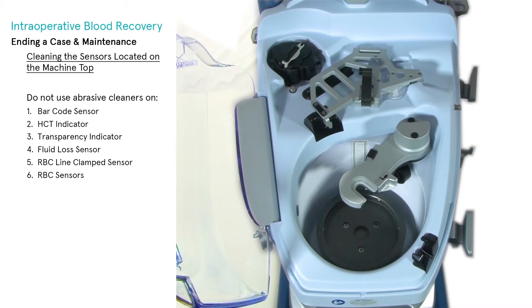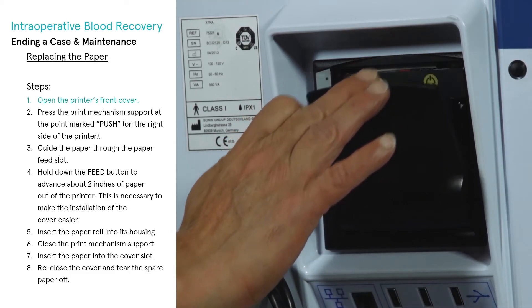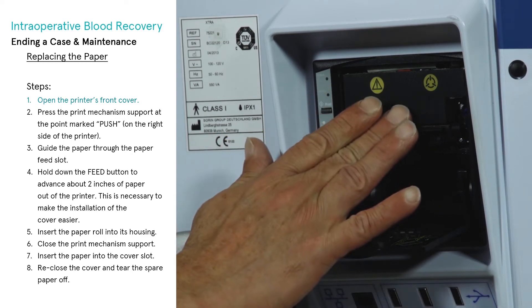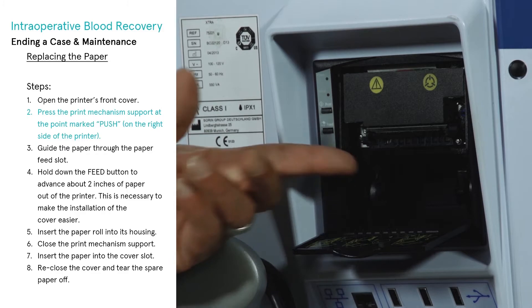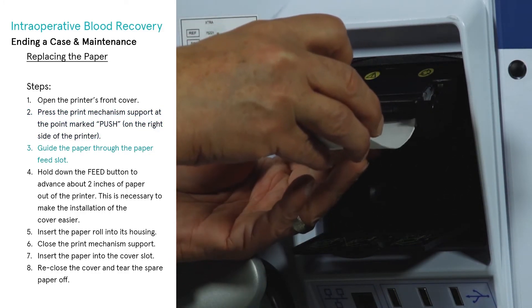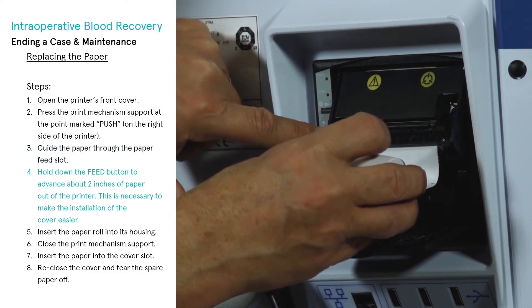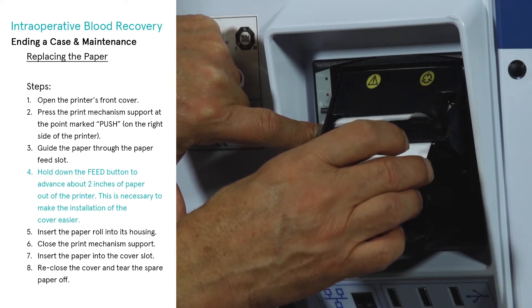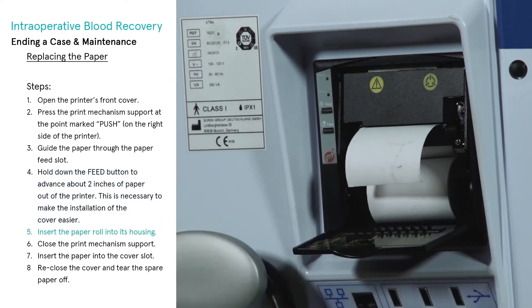Replacing the paper: perform the following steps to replace the paper roll. Open the printer's front cover. Press the print mechanism support at the point marked 'push' on the right side of the printer. Guide the paper through the paper feed slot. Hold down the feed button to advance about two inches of paper out of the printer — this is necessary to make the installation of the cover easier.